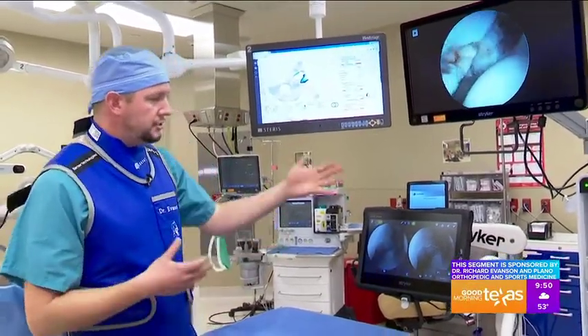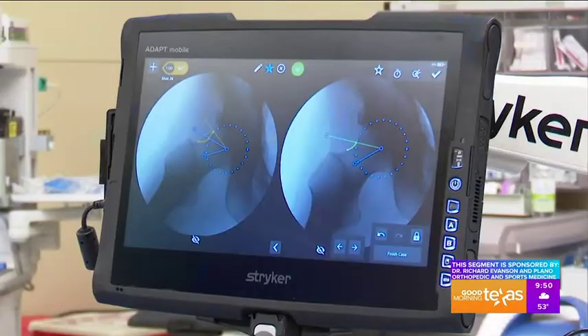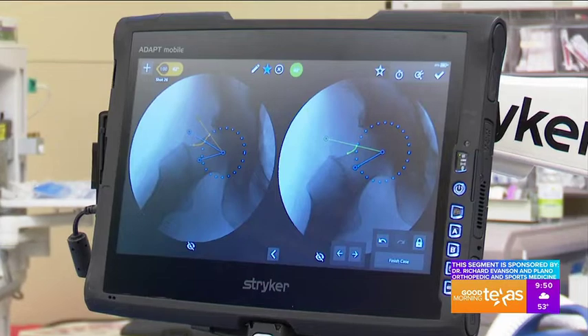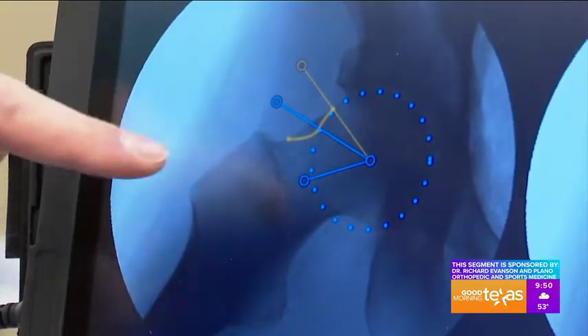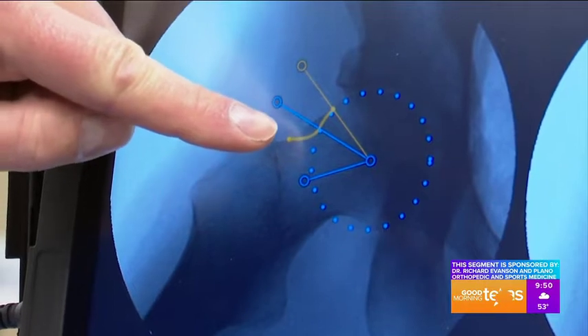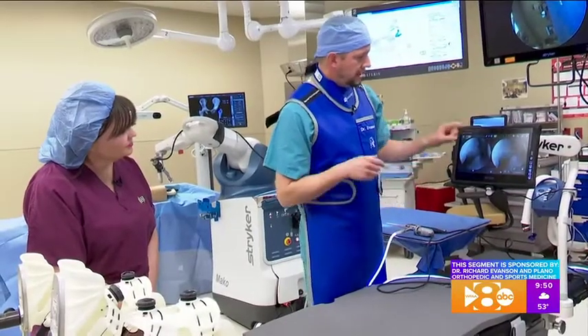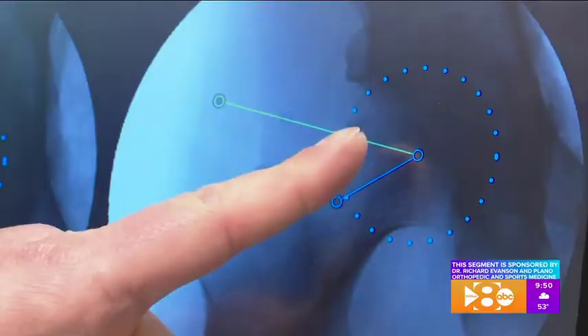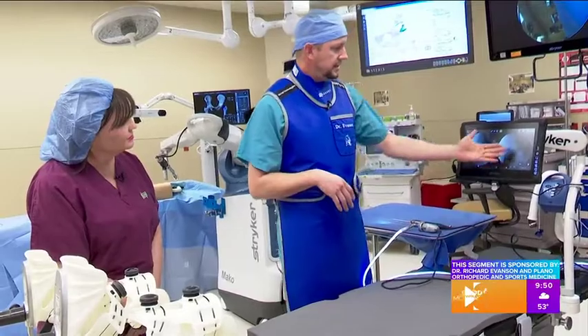The way we confirm it is using a tool called the hip check. This is a way that I can digitally confirm that I've removed the exact amount of bone. If you look at this picture here, you can see this is indicating that there's abnormal bone still present. And then after I've removed the bone, it can digitally confirm my work. This is before and this is after.